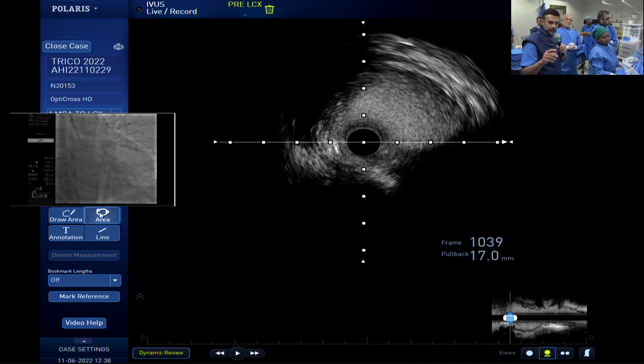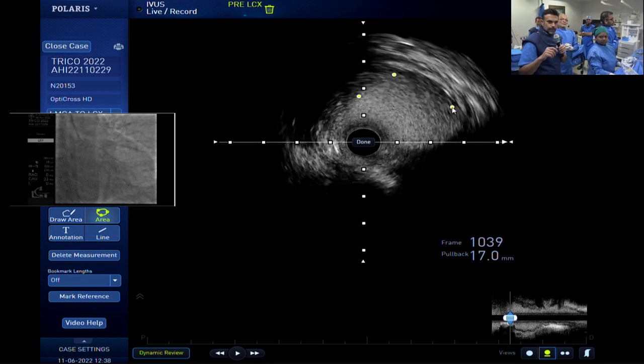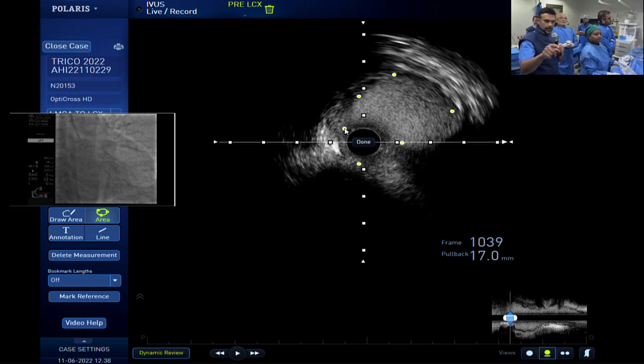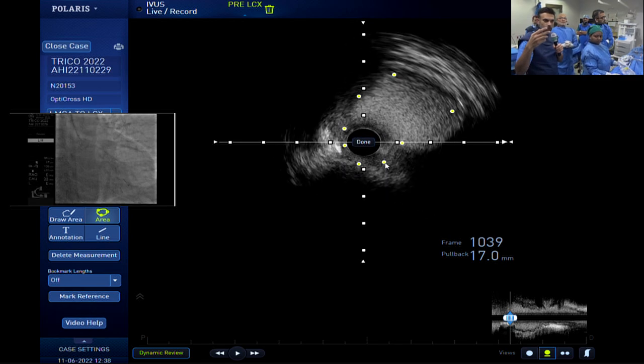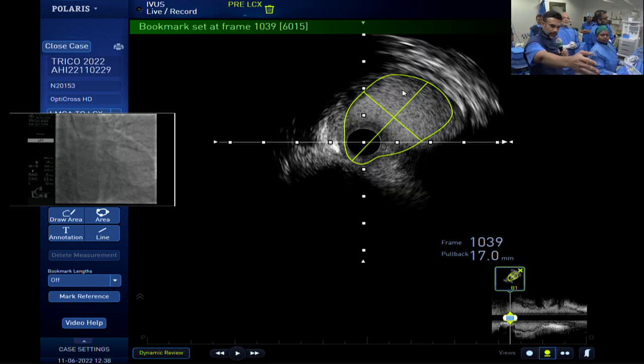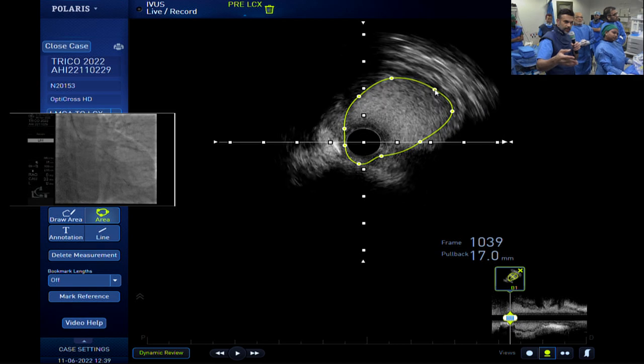The dynamic review is good because it gives you an idea of the sides of the vessel. But the more dots you put in, the better off you are, right? You get a better sense of the total area. So there, you're gonna undercut the left main a little bit at the top, but I think you're seeing here that you're nowhere near six. You're well above six, right?